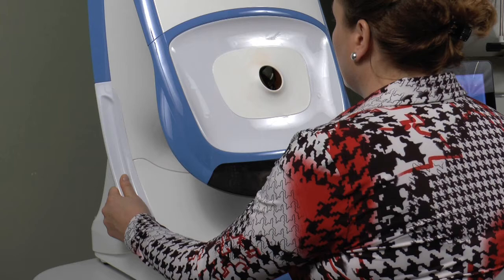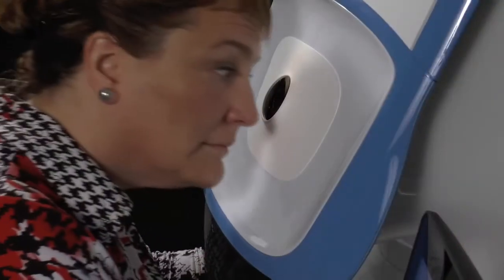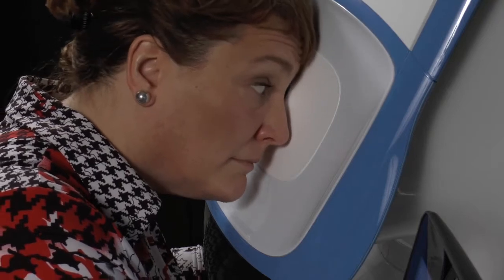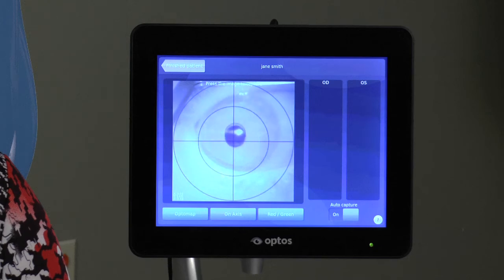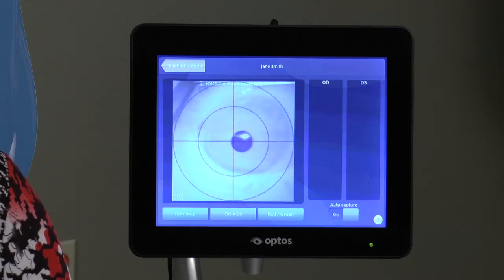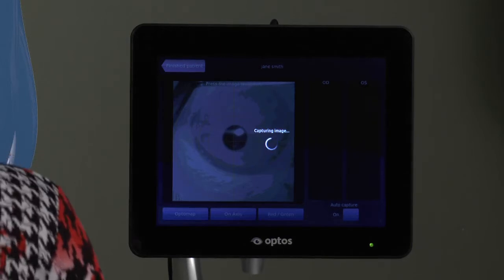You should be able to guide your patient into correct position with verbal instructions. Have them turn their head slightly and, using the eye to be imaged, center the blue alignment target in their field of view and move closer by pushing their forehead in until the alignment target turns green and an image is captured.